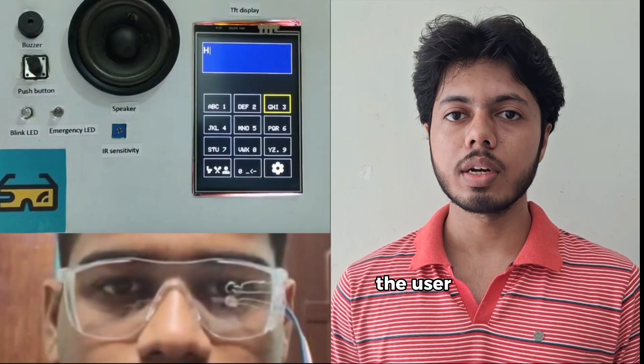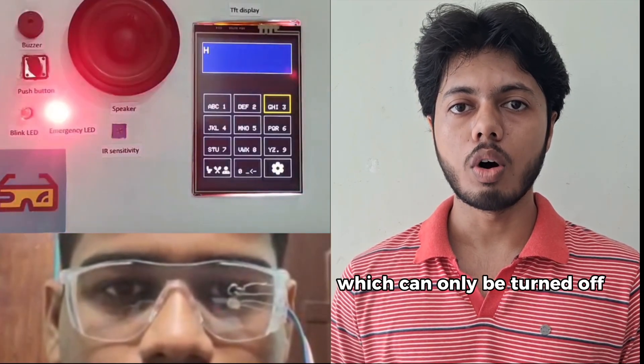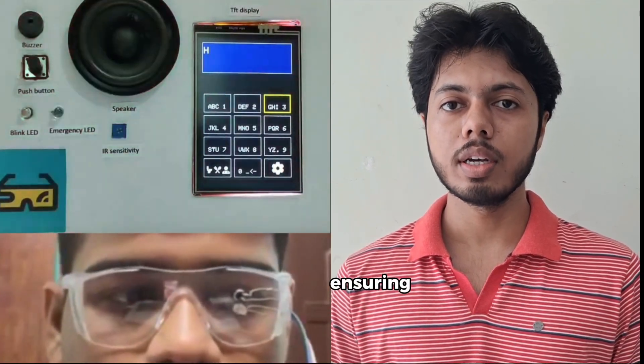With four consecutive blinks, the user can trigger the emergency mode, which will activate a buzzer and an LED light, which can only be turned off by a physical push button, ensuring there is someone attentive to the user.